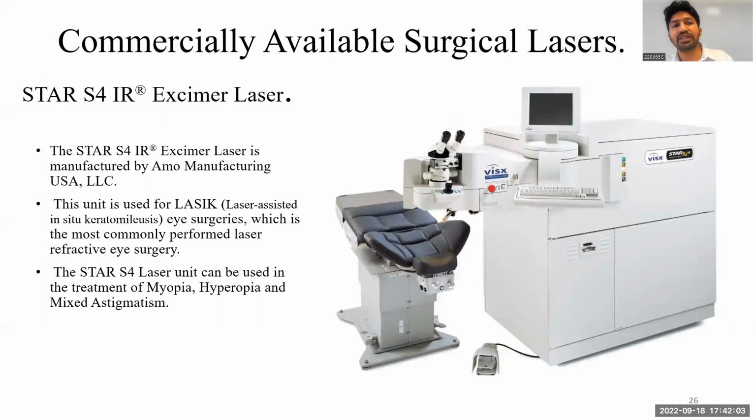The STAR S4 IR excimer laser is one of the most commonly used, or the most prominent, excimer lasers. This is used for LASIK surgery, where we try to treat myopia, hyperopia, and mixed astigmatism. So short-sightedness and long-sightedness will be treated using the STAR S4 IR laser. This is manufactured by AMO Manufacturing USA.